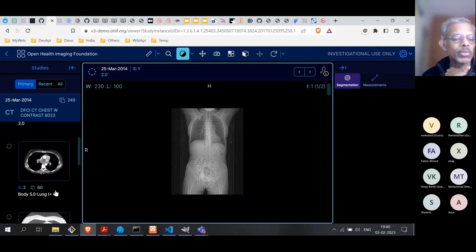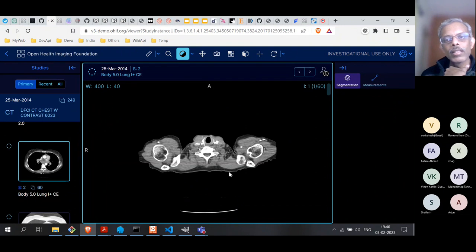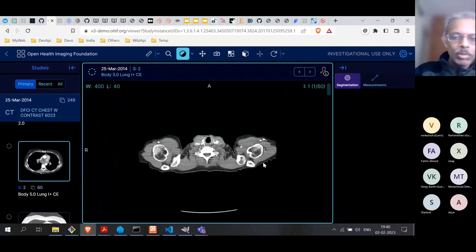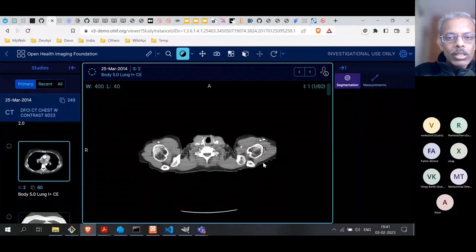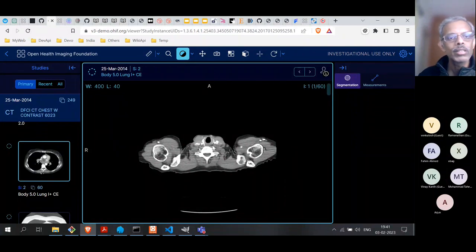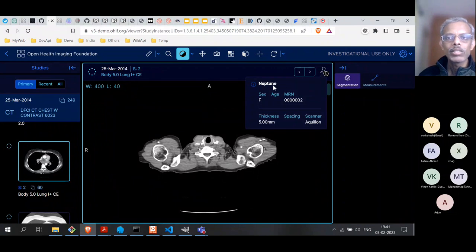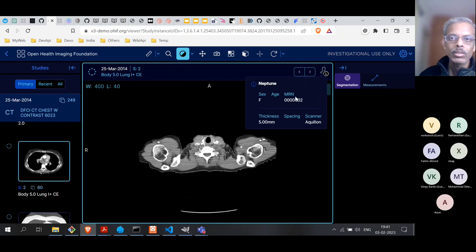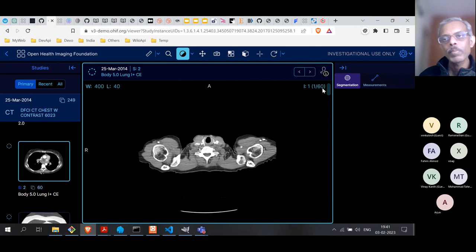We can take a look at one of them — for example, Body 5.0 Lung. So this is a lung scan. We need to double-click and then the scan comes up. Now there are actually 60 images in the scan. Many of these equipment, whether it's MRI or CT scan, don't take a single image — they take slices of the body, so you end up with multiple images in a single scan. This particular scan was done on 25th March 2014. If you click here, you get a pop-up giving details of the patient — sex, age, patient number, and some details of the scan. This should be considered metadata, which is important to keep in mind.